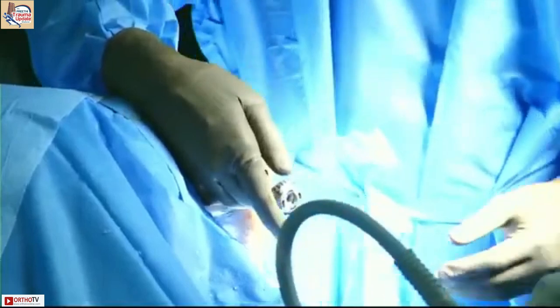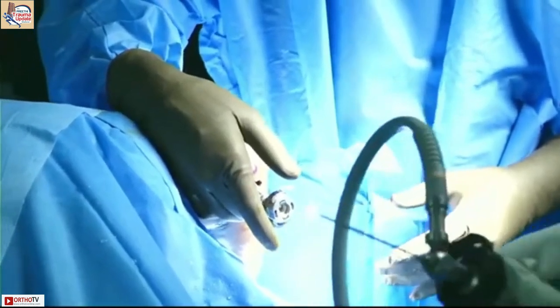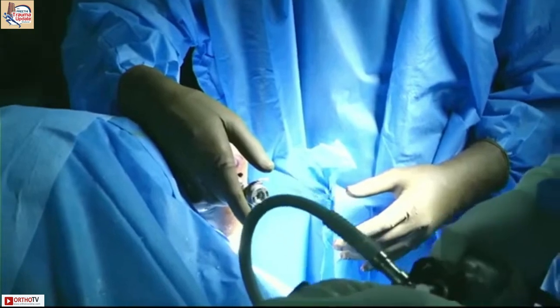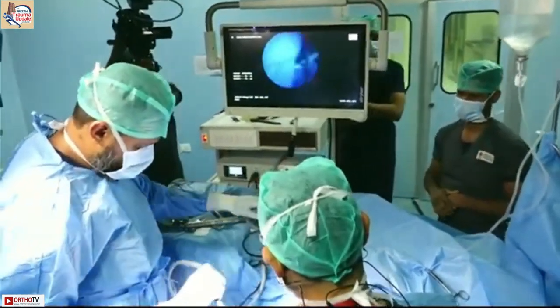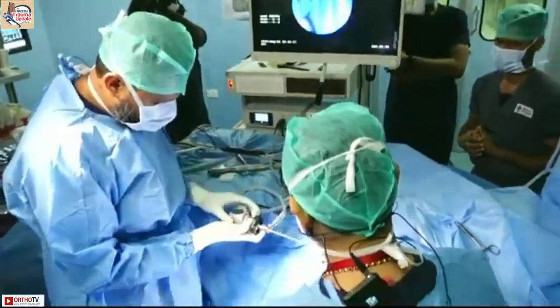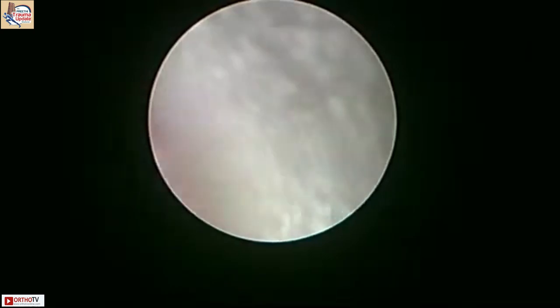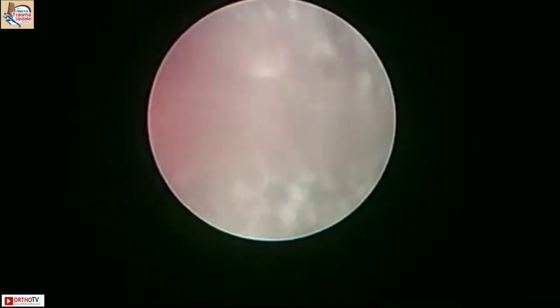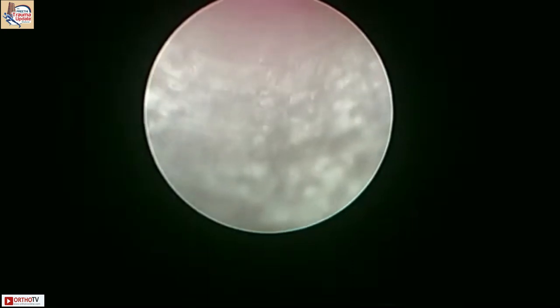Sister, can I have a scope, please? Not very good. Okay, we'll make it work. So we're shifting to 2.7. That's okay. We'll connect the inflow. It should just click. In elbow scopy, they say that once you insert the viewing portal and come out, going back is always a challenge. Do you agree with that? And things to avoid? Is the sheath longer than the scope by any chance? Because I can only see the sheath.